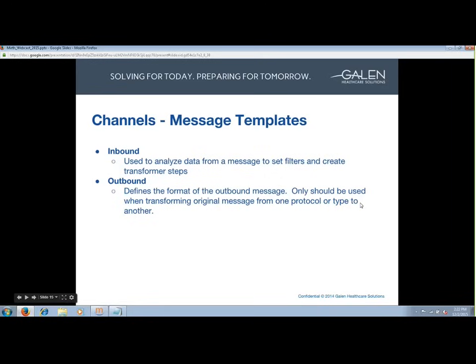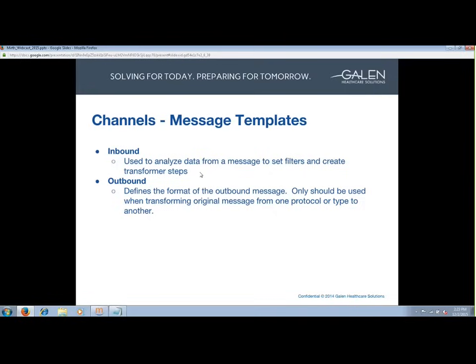Next up, message templates. There are two types: inbound, which is used to analyze data from a message to set filters and create transformer steps, and outbound, which defines the format of the outbound message. We haven't had too many uses for these other than being really helpful when building out filters and transformer steps. I'm going to show you how to use a message template when we jump into filters.